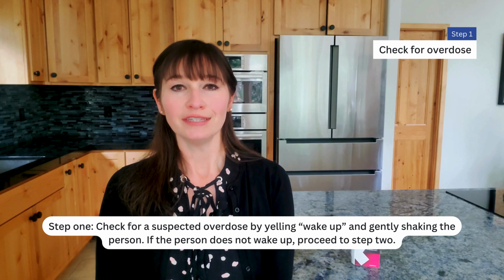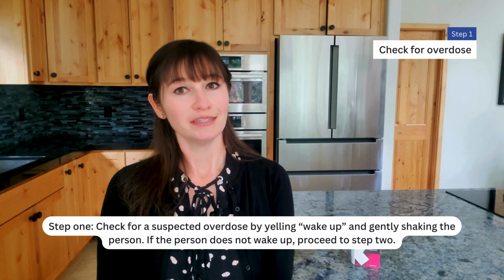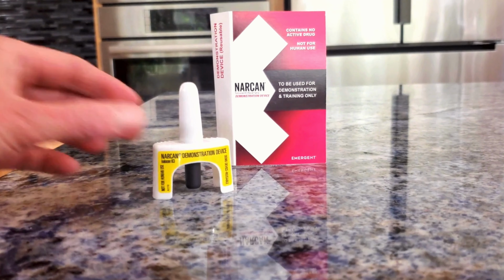Step 1. Check for a suspected overdose by yelling, "Wake up," and gently shaking the person. If the person does not wake up, proceed to Step 2.